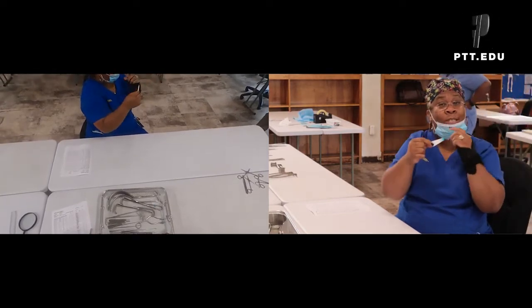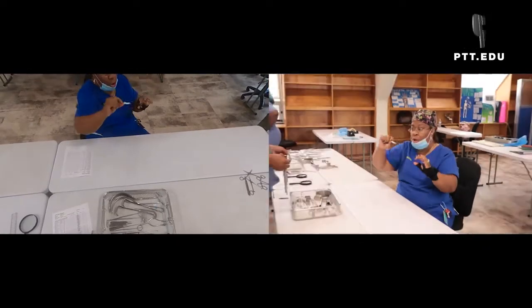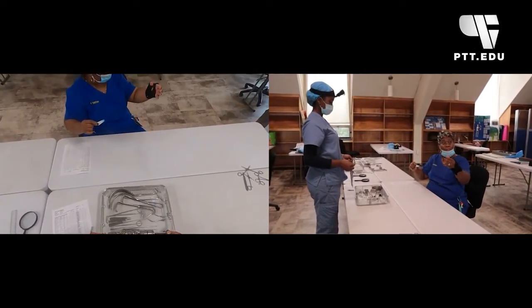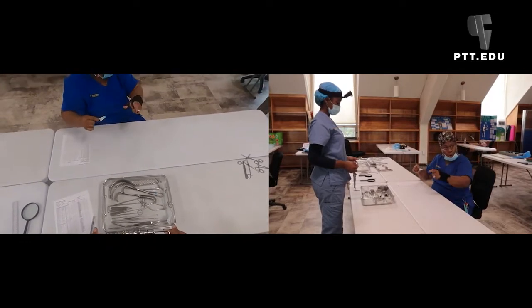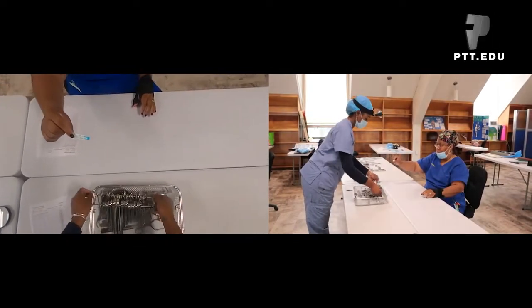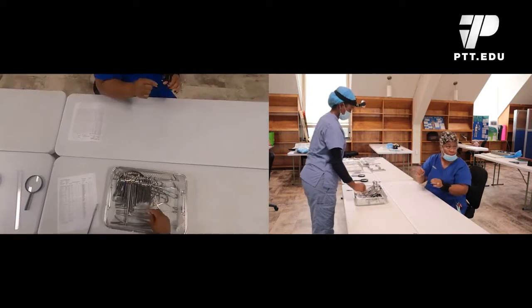That means that the sterilization process has been completed, and we always try to put these in the hardest to reach places inside of our trays to make sure that when the sterilization process is going on, the sterilant hits the hardest spots. So where we're going to place this, I'm going to look at. There you go. She stuck it up under something.